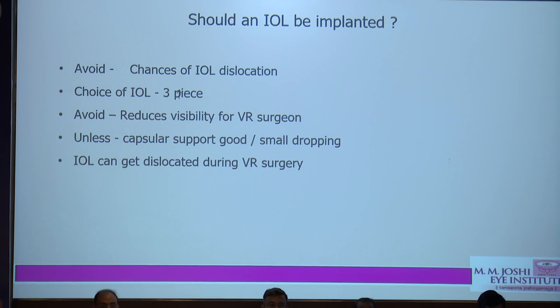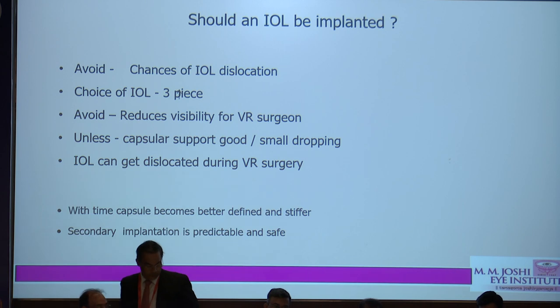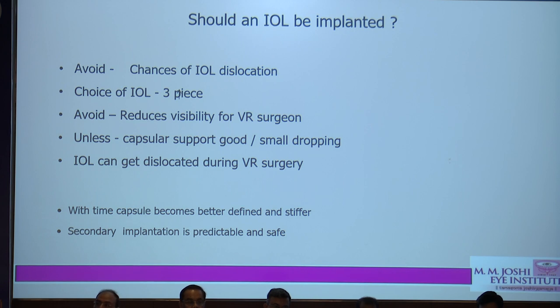Then the IOL can get dislodged while putting in the ports or while inserting the infusion; sometimes if it is not placed very well, we have seen the haptic coming up and not getting good support. So with time, the capsule becomes more and more defined and stiffer. In fact, I suggest the anterior segment surgeons at least defer for some time if you don't have support, because as we all know, in around 10 to 15 days the capsule becomes more and more stiff. That is the capsular phimosis, what we call. Secondary IOL implantation is always predictable and safe.